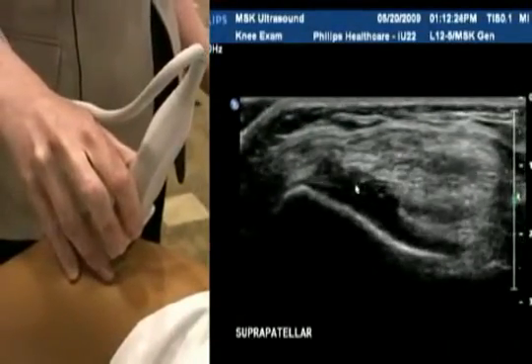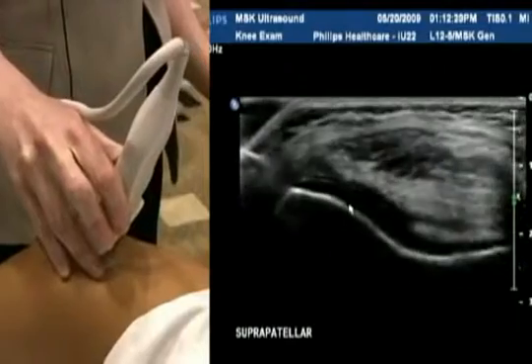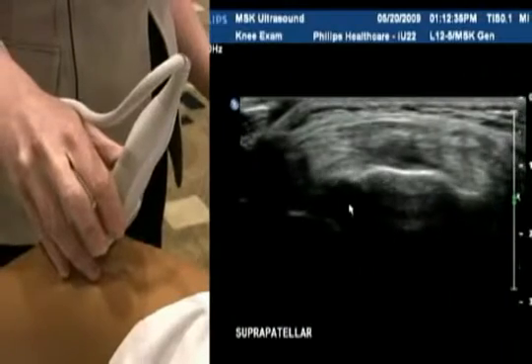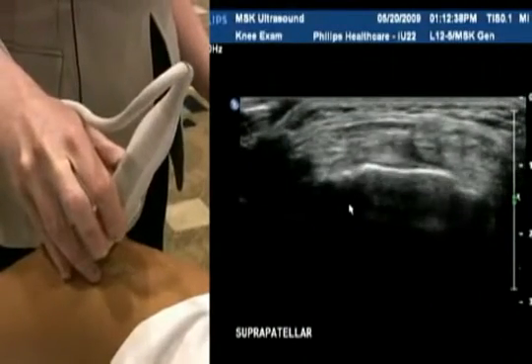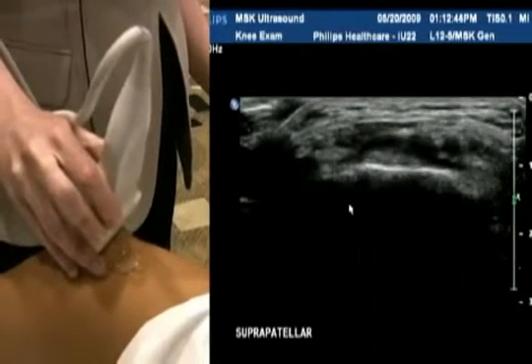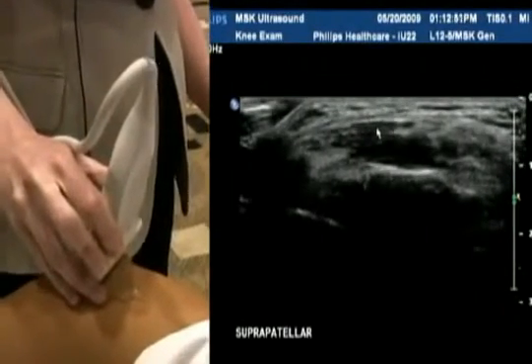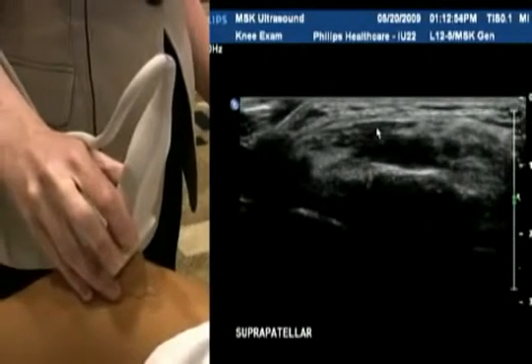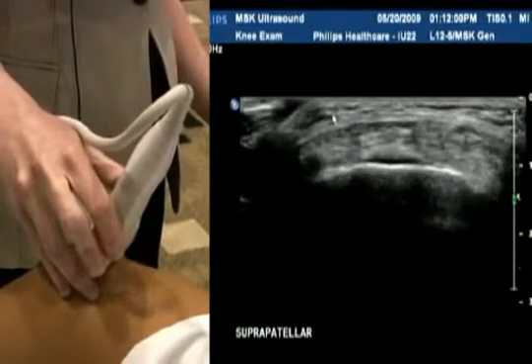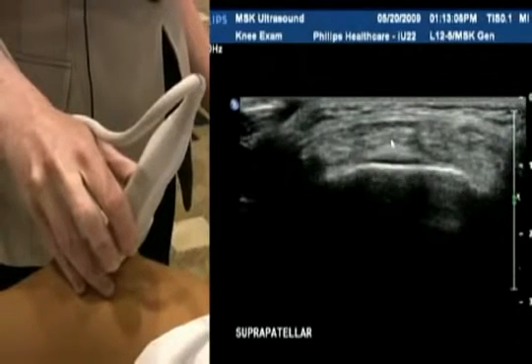As we scan down towards the patella, you come into this small amount of fluid here — quite normal, nothing to worry about. We scan all the way down until its insertion on the patella. You have to be a little careful with anisotropy here and make sure that you heel-toe the probe effectively, because if we heel more than a few degrees away from perpendicular, you can see how hypoechoic this tendon becomes. That's indicative of tendon tearing, tendon inflammation, or tendinosis — so you don't want to create a false positive. Make sure that you keep 100% perpendicular to the tendon. You can see that the fibers fill in and it becomes nice and echogenic, which is exactly what you're looking for.